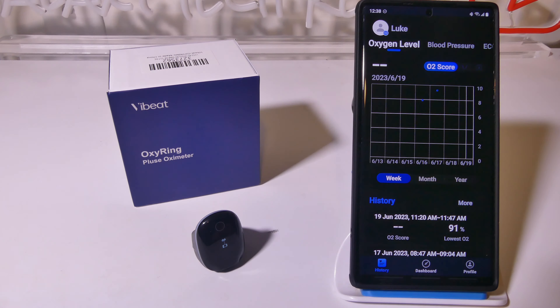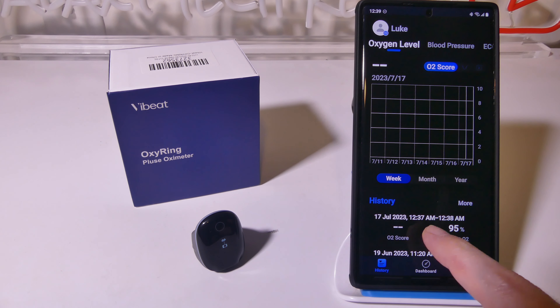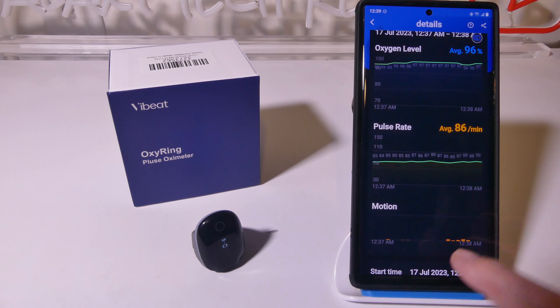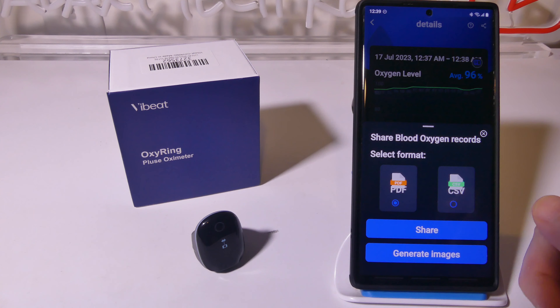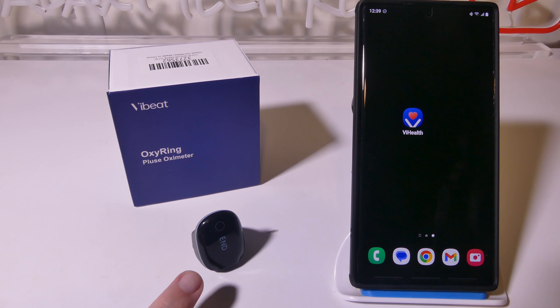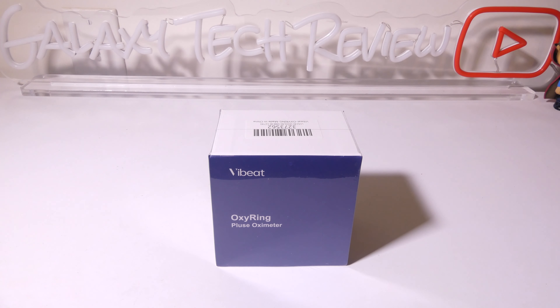It'll also track your motion, so if you use this while you're sleeping you can see how much you move around as well. This is great for tracking your SpO2 while you're sleeping — you'll easily get eight hours, no problem. You can track your heart rate and SpO2, and if you go over to history, you can see that the history will be there for what we just did. I can look at my average oxygen level, pulse rate, my motion, how long we've been tracking it, and then I can share this either as a PDF or a CSV file — I can share this with my doctor or healthcare provider, or just keep it for my records.